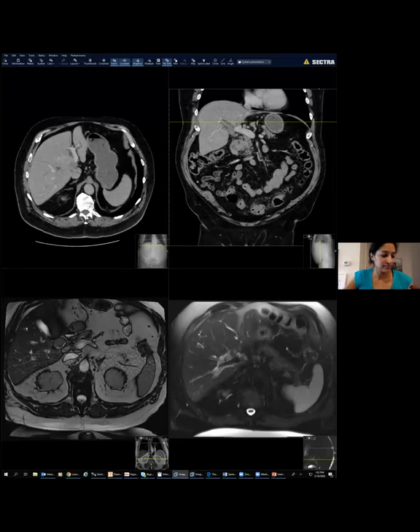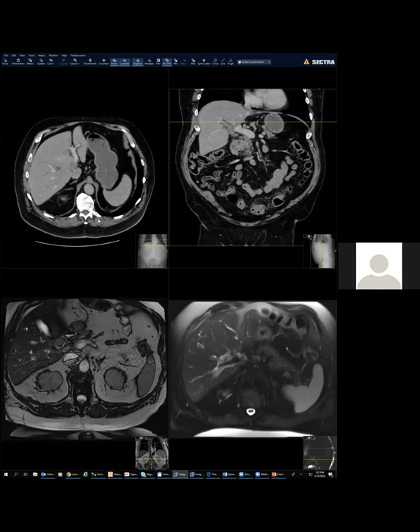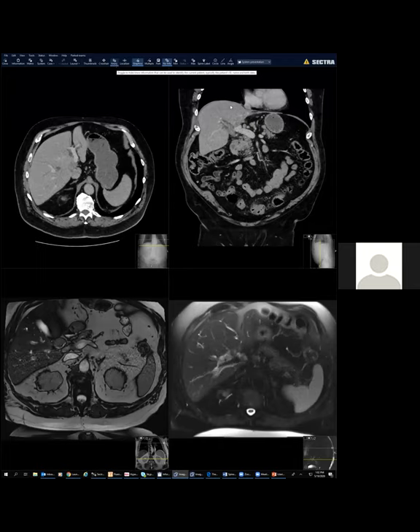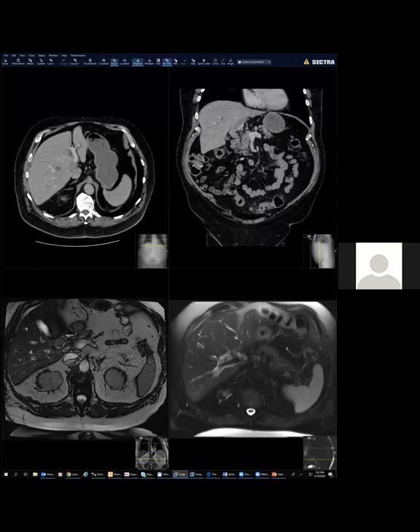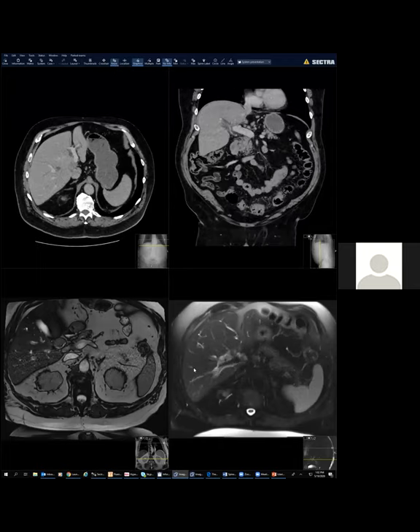This is an interesting case. There's a 69-year-old gentleman who presented with obstructive jaundice, and I am going to scroll through the CT images first.